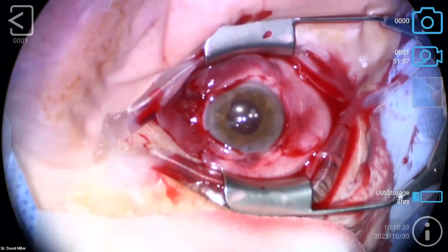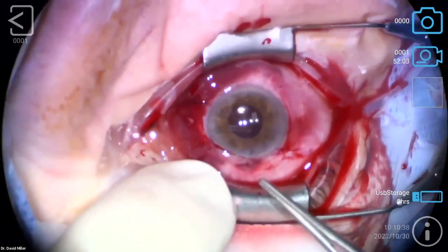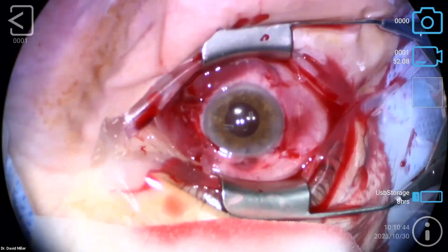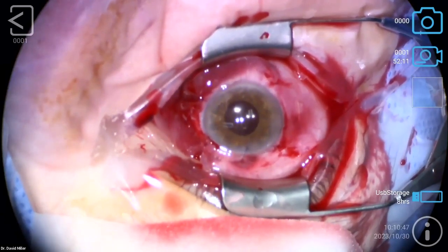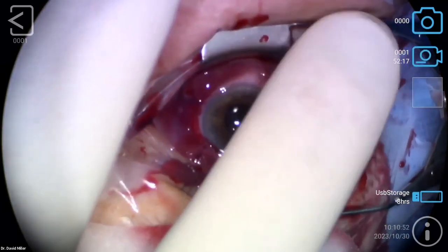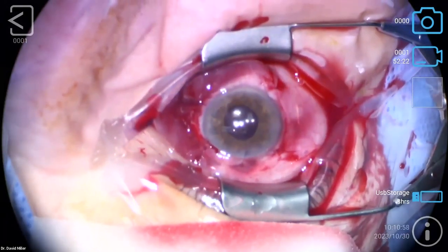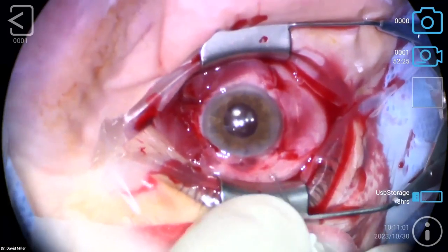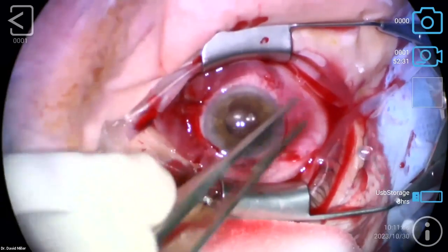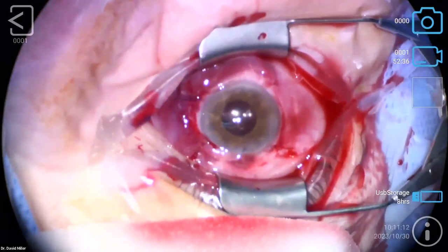Okay, squirt us all down. You got a little BSS to reconstitute the eye? And so here's that one suture, clearly visible, well covered. The eye's just a little soft. How about a needle, 30 gauge? Very little, one of the broken Tenon's, very little BSS to put in the eye there. We're nice and firm, holding pressure very well.